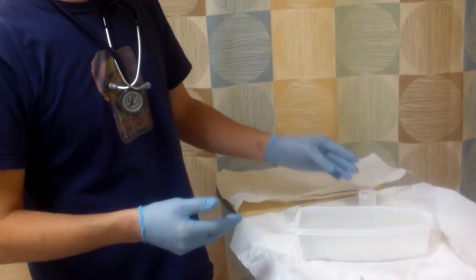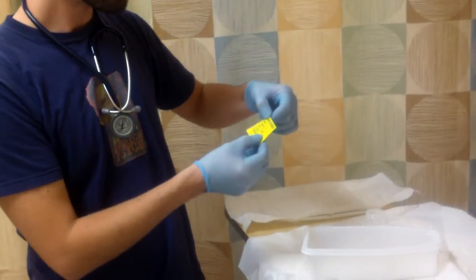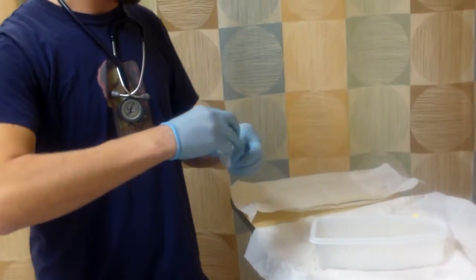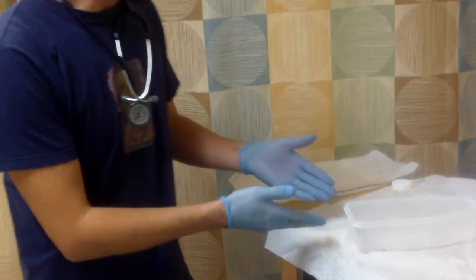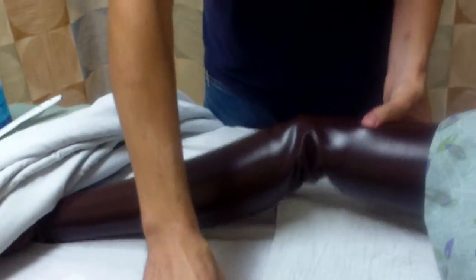And I would also get my specimen. I would do the name of the patient, the room number, the date, the time, doctor's instructions, what we're looking for, label it, put my initials there, and put this in a bio bag, and then send it right to lab or put it on ice, and that would be done. I would also want to measure the residual urine and note that on how much I relieve my patient for. So that's done. So my patient is then, his legs back to normal here.